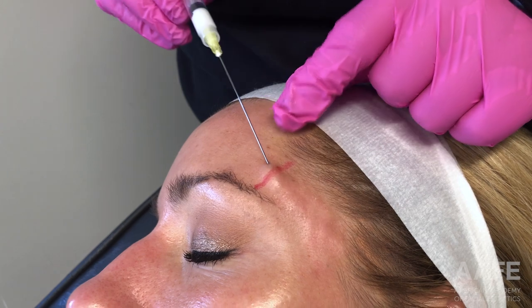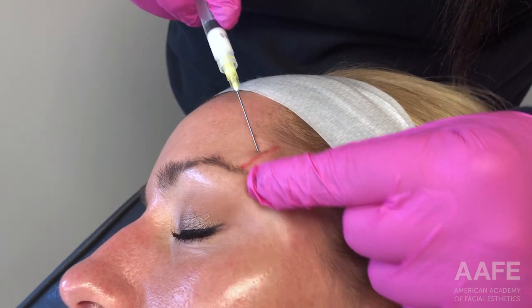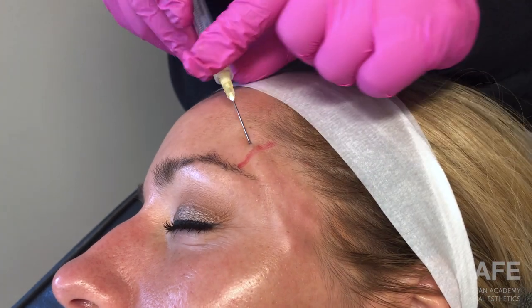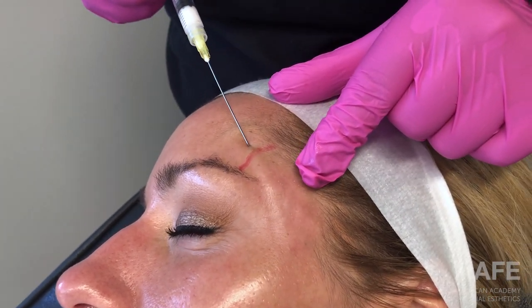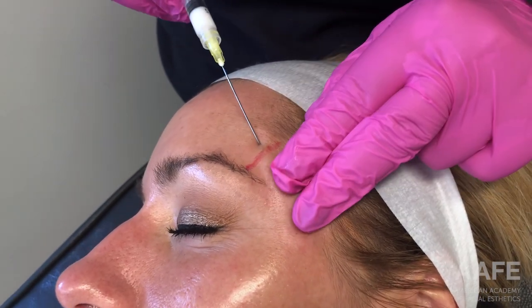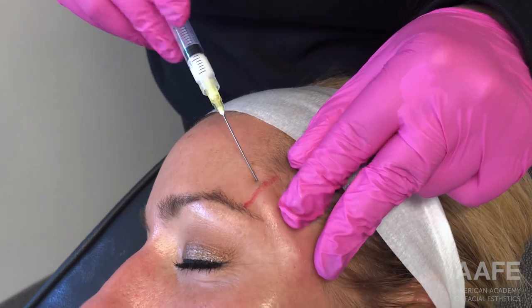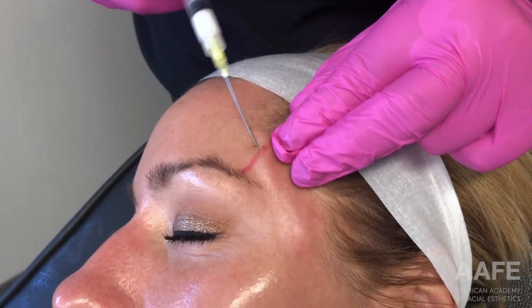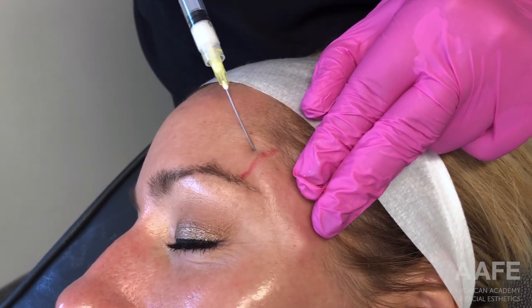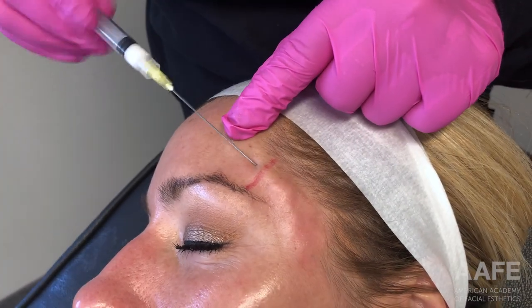We are fanning the material through the temple, retrograding out and laying the Radiesse upon exit. You can see it does appear a little lumpy, but once you have completed your procedure, we always give the patient a nice massage. This is nothing they are required to do at home — unlike other biostimulatory products, dilute Radiesse generally does not require post-procedure massage from the patient. I like to do it before they leave just to make sure everything is nice and smooth.